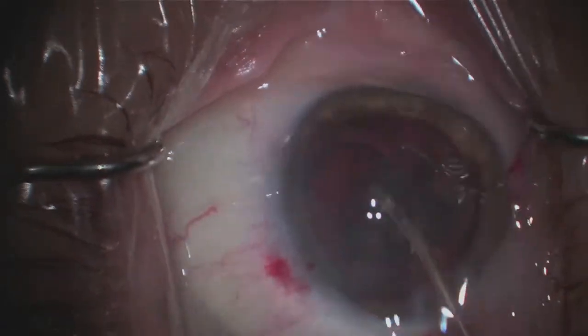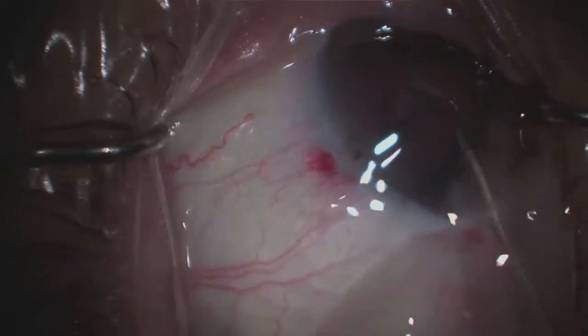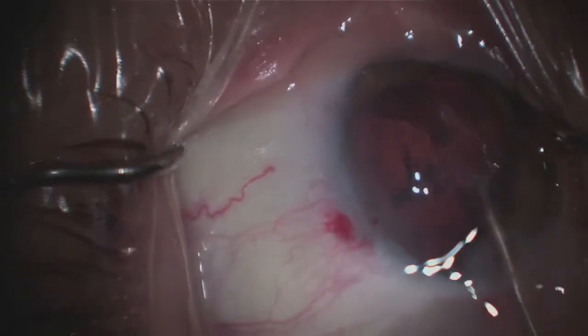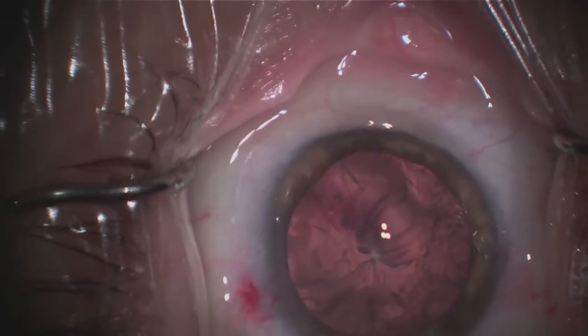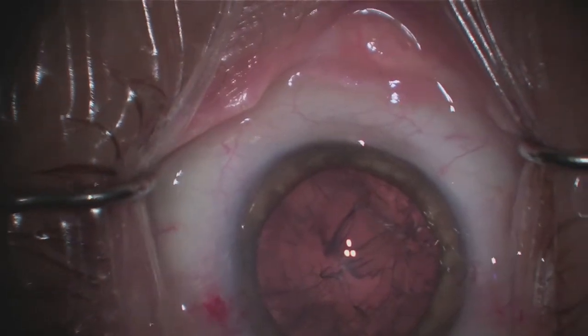Just the two remaining pieces are present. The patient has received topical medication to control any pain, and they do not have any pain during the procedure — even as I'm moving the eye around.